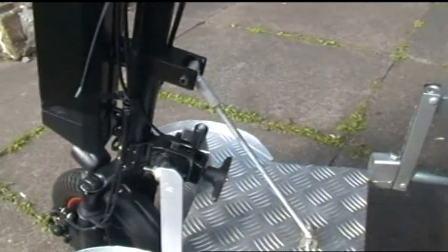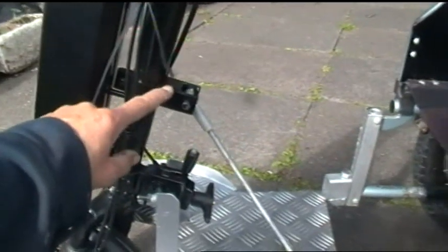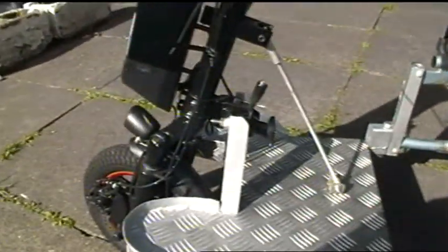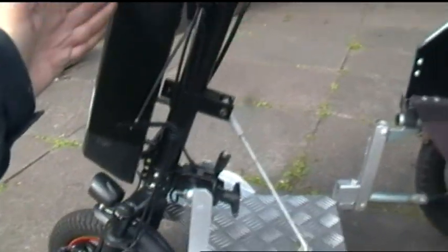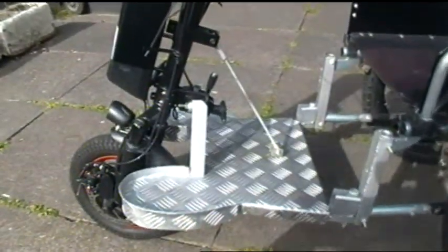I've had to put this brace bar on here to basically stop the handlebars from moving backwards and forwards, obviously. And from the original video, this swivel point used to be up here, and this mounting point for sort of like a footrest or something used to be down here. So I swapped them round, and I've come up with a system where I could now disconnect that link bar there, the brace, and then undo that screw there, and this will actually swivel over and fold in across the battery area, so you can actually fold it up and put it in a car, not too hard.